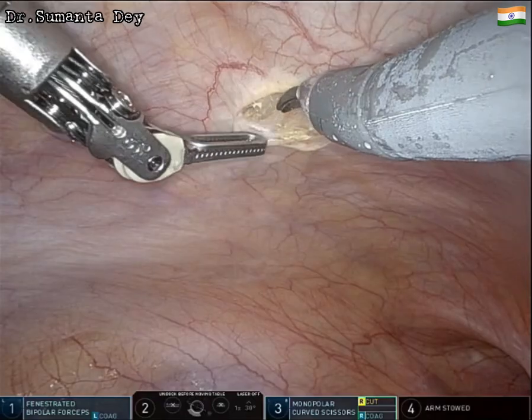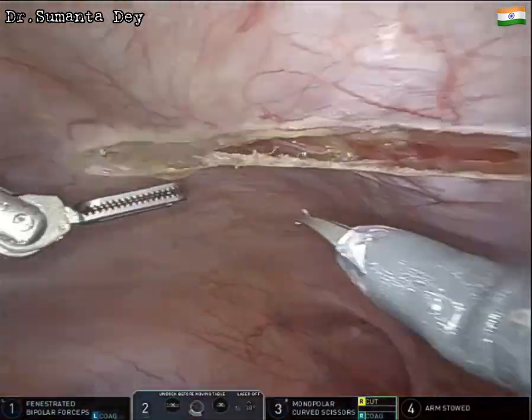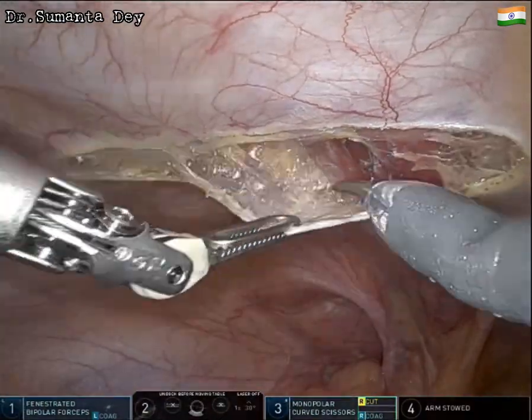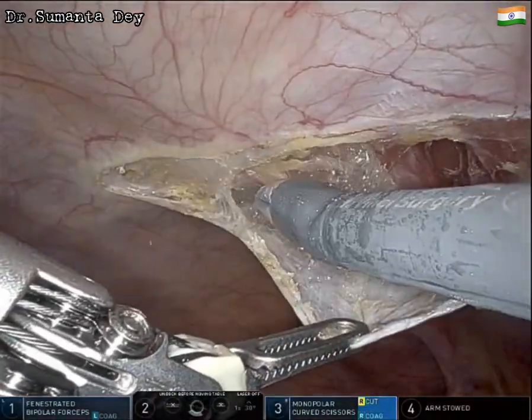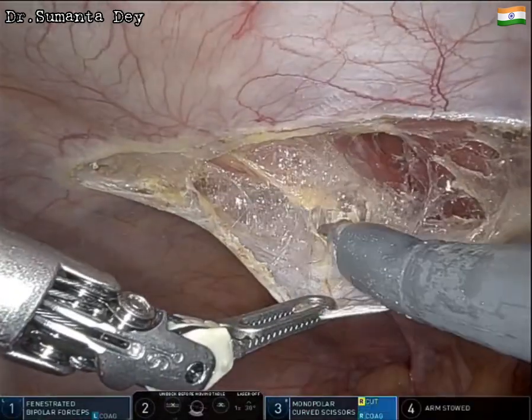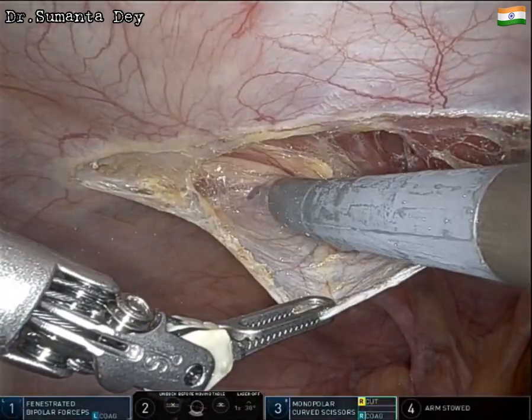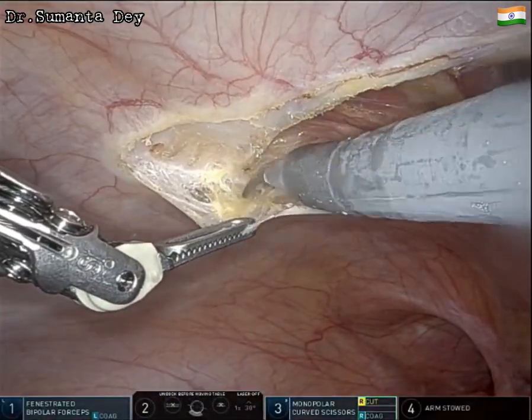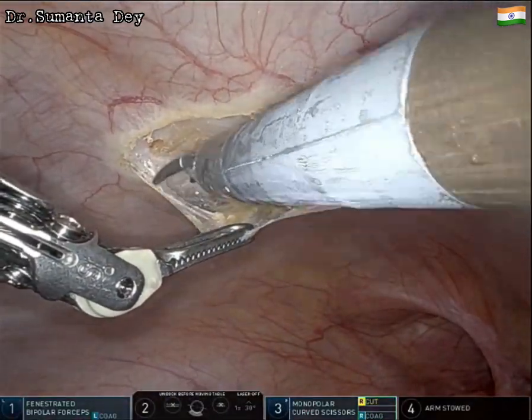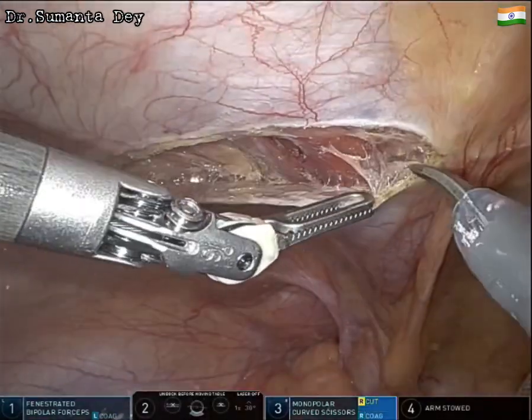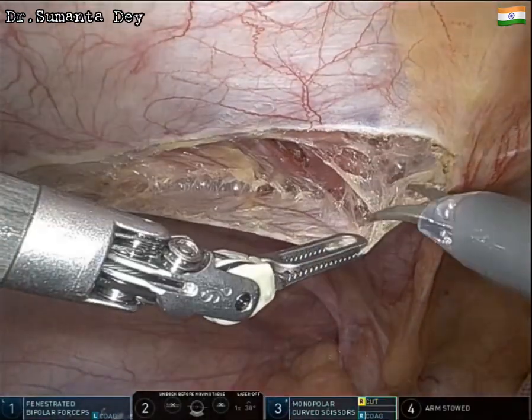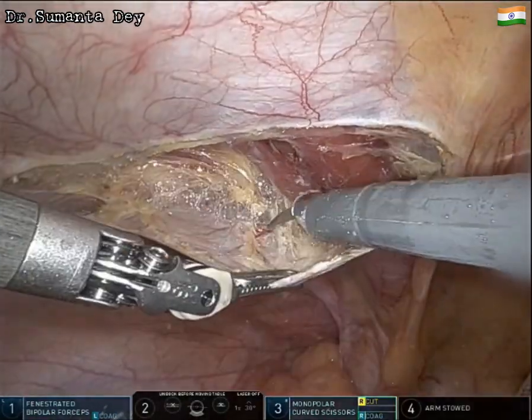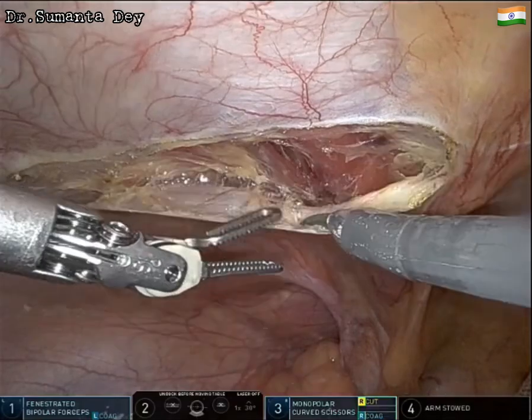The procedure was performed using the DaVinci X robot with three robotic arms in addition to the camera port. In the right hand, a monopolar scissor (MCS) is used, and in the left hand, a fenestrated bipolar grasper. After going inside, the hernia contents are reduced and a peritoneal incision is made.